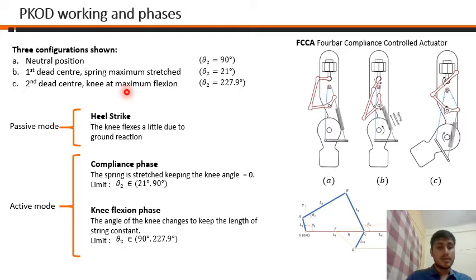Here, we will explain the working of the orthotic device. So this part is attached to the thigh and this lower part is attached to the lower leg, and A, B, C show the different configurations of the mechanism where B and C belong to the extremes. In the natural position, the spring is at its natural length and the string is taut. At the first dead center, the spring is at its maximum length, and the degree to which we need to approach this extreme position is determined by the terrain we are walking on and the maximum knee stiffness which is required.